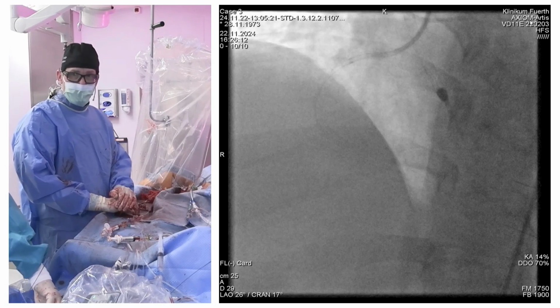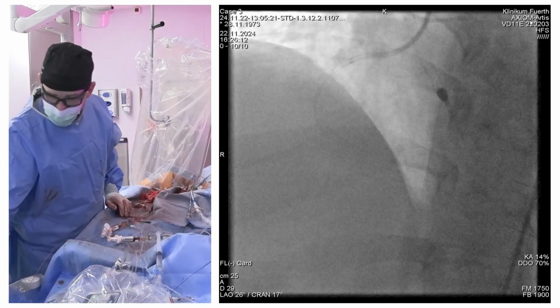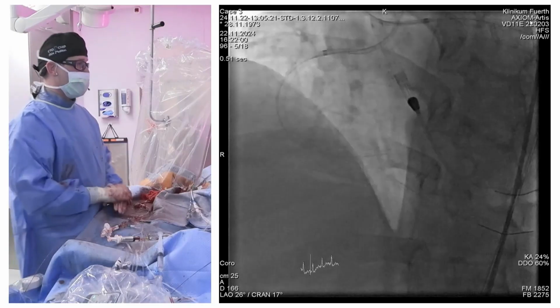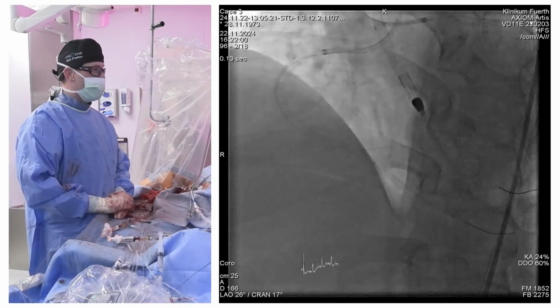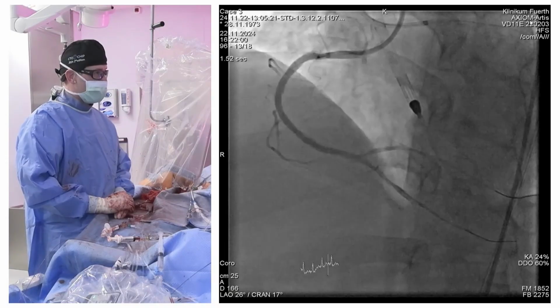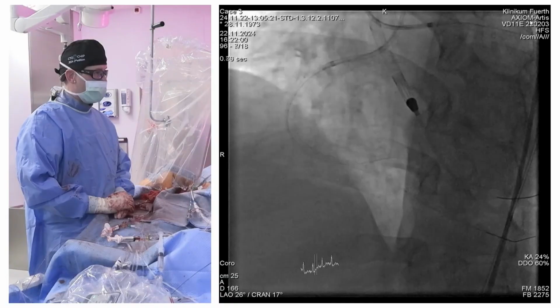So Felix, is this in the stent, in the gap that has no stent maybe, or no? So did you identify the segment where this gap is? Yeah, I think this is the case. I think that's the part which looks a little odd here in the angio, shortly before the bifurcation.